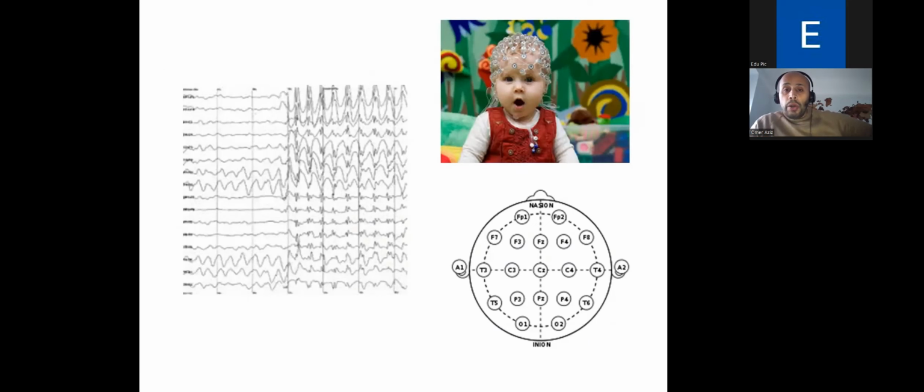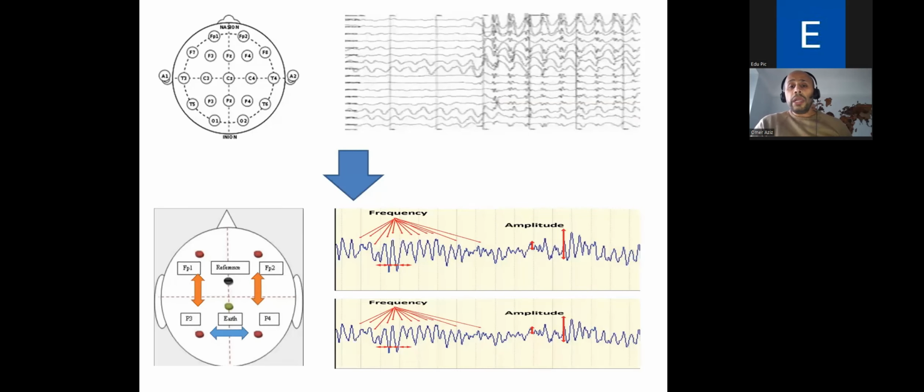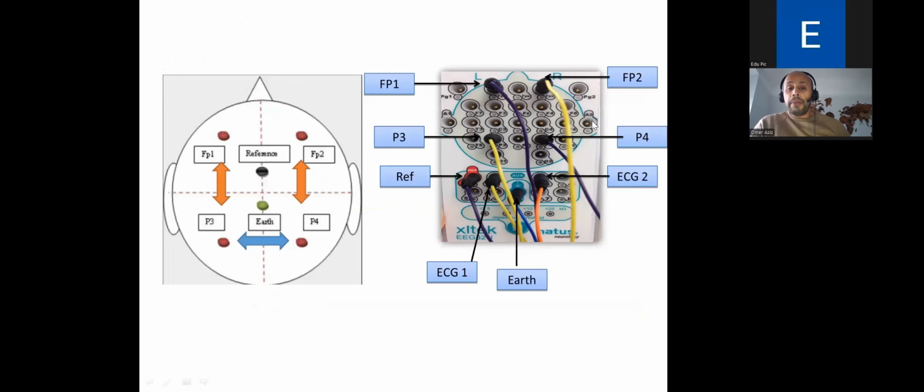So we don't have that available 24/7 in the PICU, so the next question is, is electrical monitoring of the brain important in the critical care environment? I'm going to try and argue why it is important and what evidence there is behind it. So clearly, if you don't have the full head EEG or the results immediately available, what's the alternative? So we can then change it to what we call the CFAM.